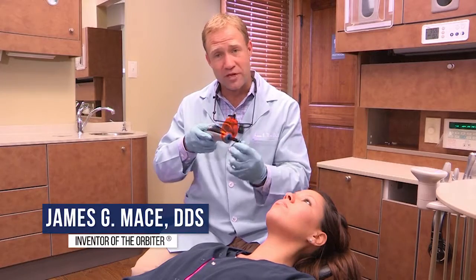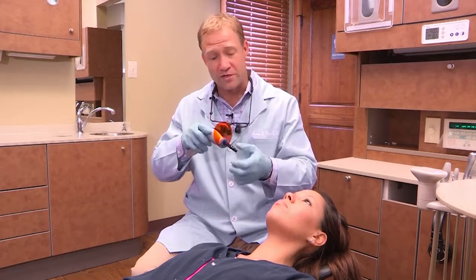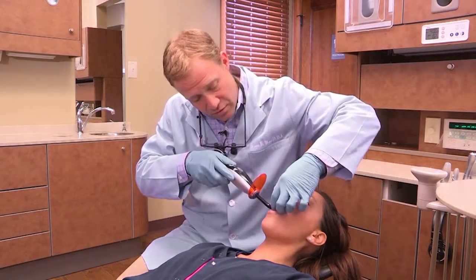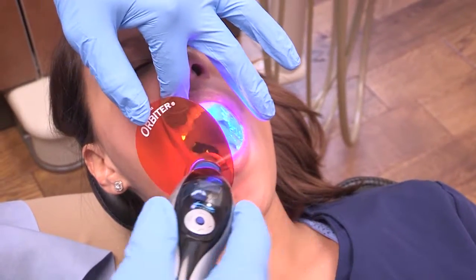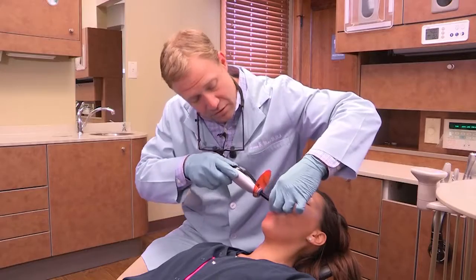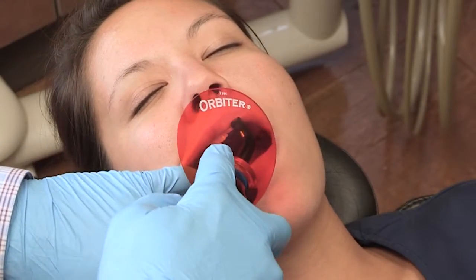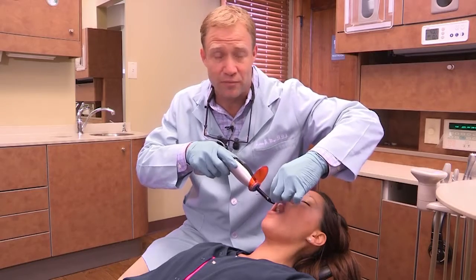The most efficient way to use the orbiter is to grab the curing light, simply rotate the position of the tip to the right orientation. You go into the mouth and cure. Most surfaces, just rotating the tip is all you have to do, and the filter ends up being in the correct orientation so your eyes are protected.